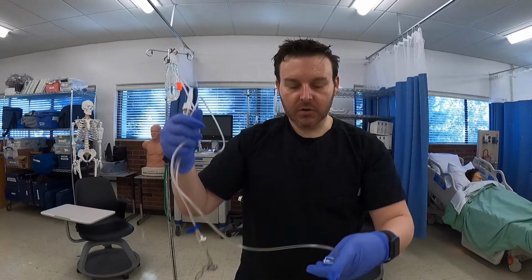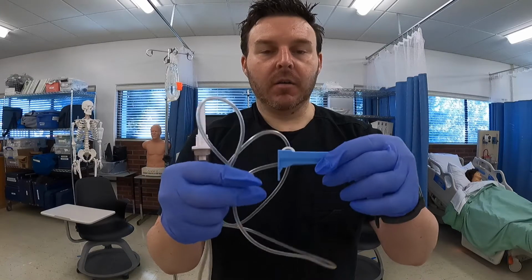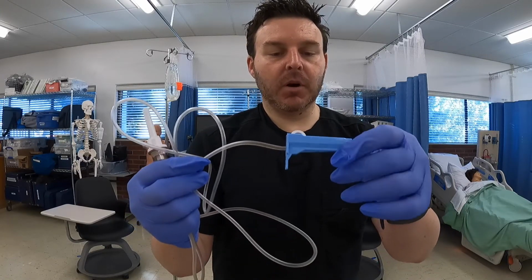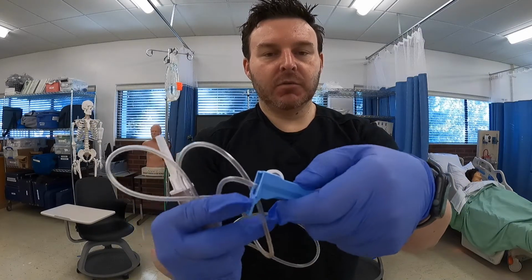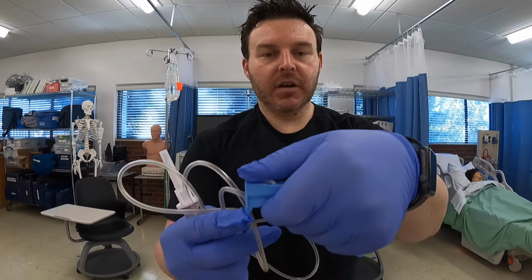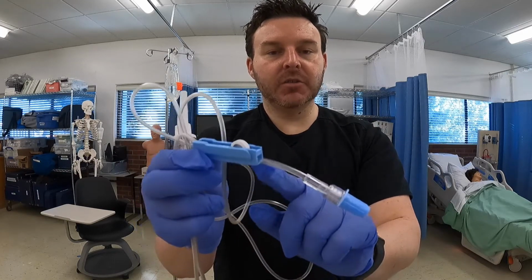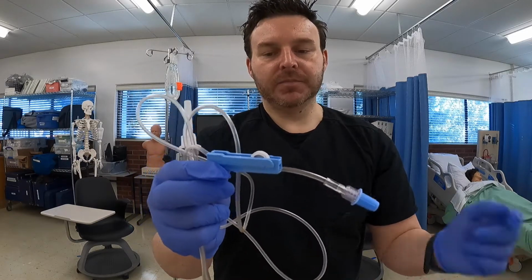The other thing you'll want to note is this clamp, and this clamp is called a roller clamp. And right now it's in the full open position. The wheel's at the part closest to the front with this part here. And for this to work, we basically will just take our thumb and move it backwards. And then what it does is it compresses the tubing here and will not let any fluid run out.